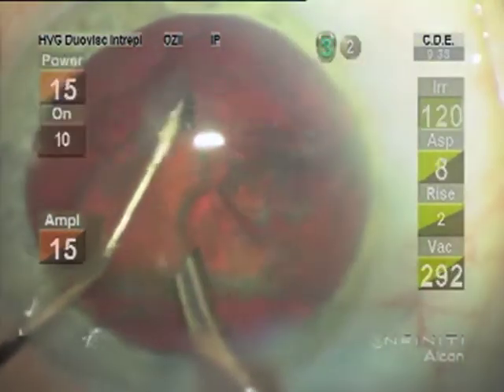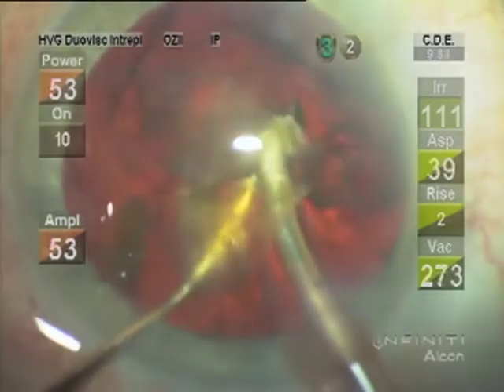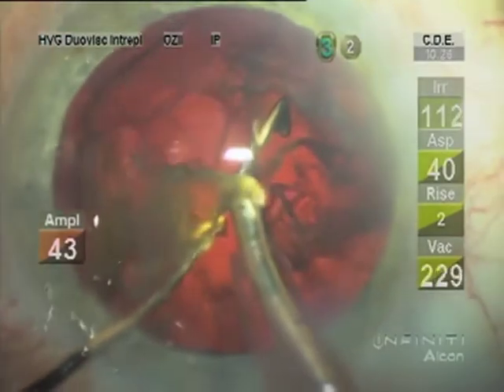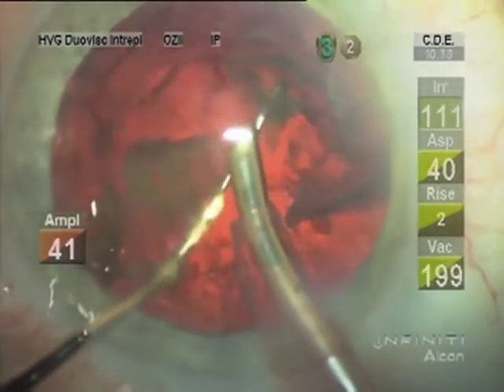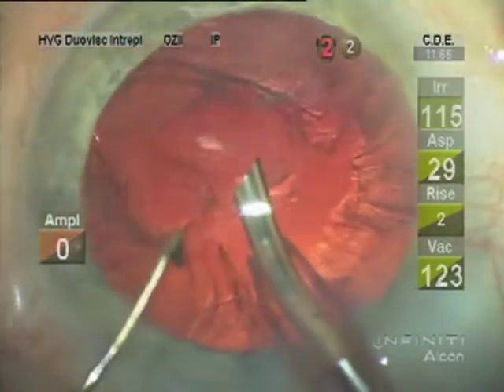I like to keep chopping things as small as possible — it just helps the followability. I don't like to maneuver the tip very much; just let things come to the tip and always protect the posterior capsule.